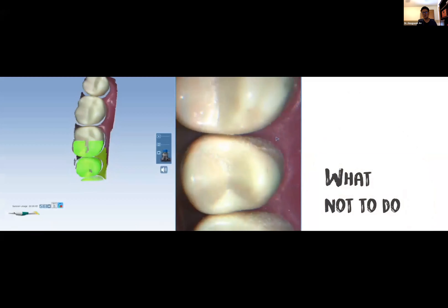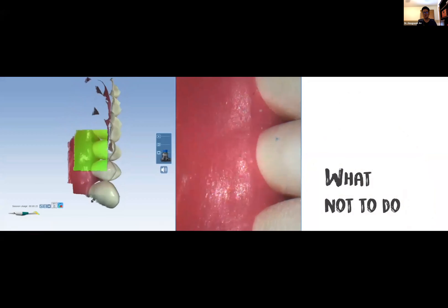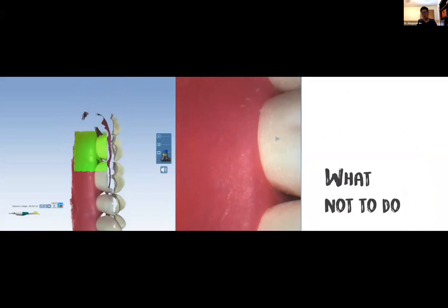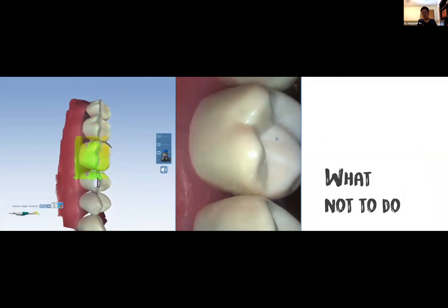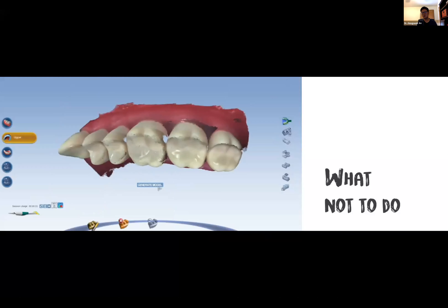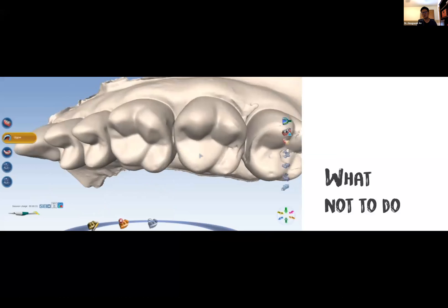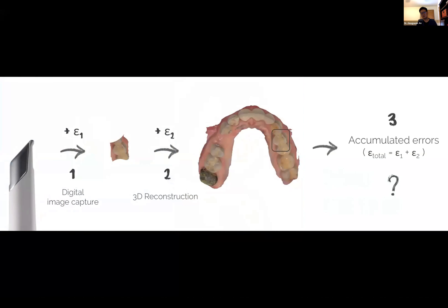Here is an example of what not to do: scanning through the occlusal surface — so far so good — but as I go to the buccal side, my buccal scan does not have a good amount of overlap with my occlusal scan. Now trying to merge them by scanning the missed area between occlusal and buccal surfaces, you can already see that those images were not merged together properly — the occlusal surface is the accurate one and the buccal surface had the error — and the computer couldn't fix that problem. So this is not an accurate scan at all.